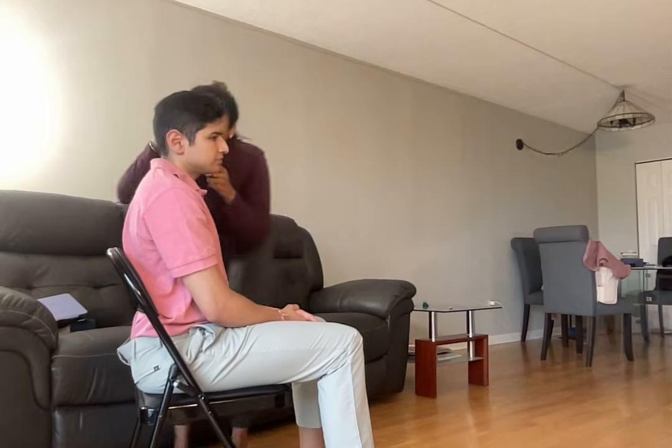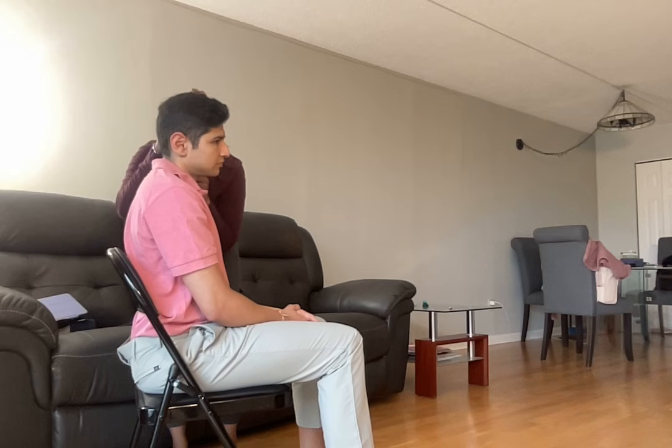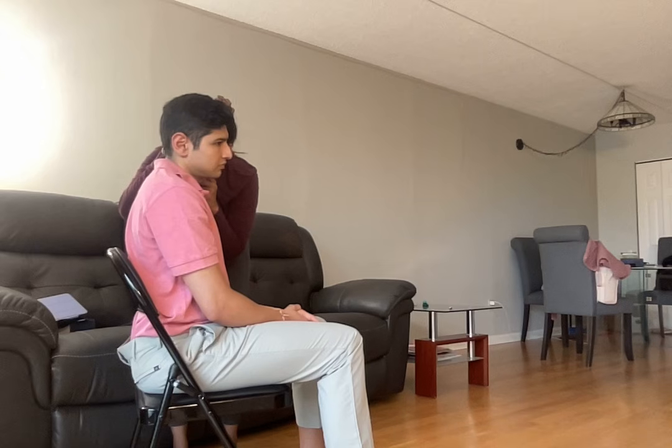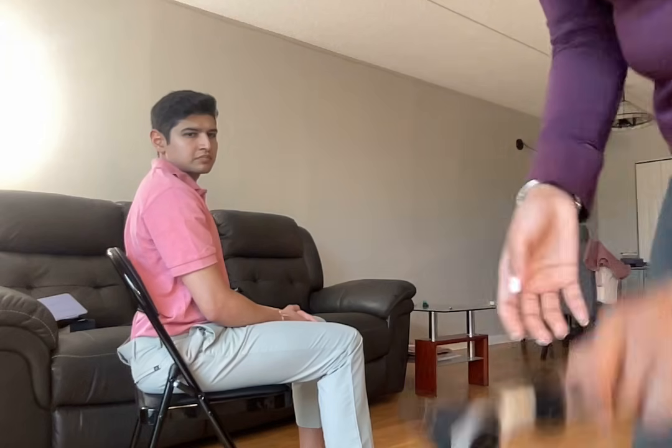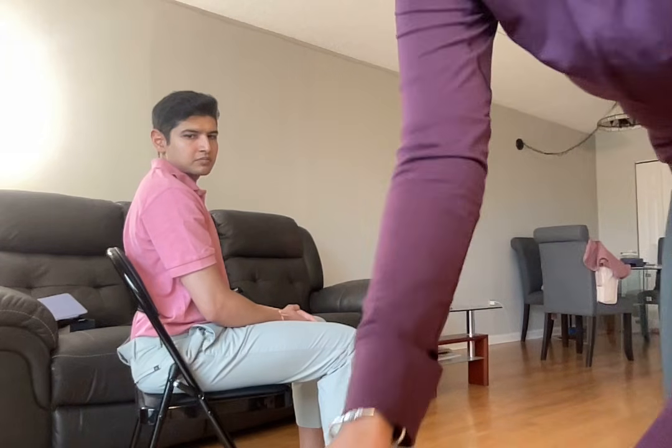I'm going to do the same thing on this side. I'm going to pull it up and back towards me. And I can see that there's a little bit of cerumen, but no foreign body, no foreign object, or any discharge or drainage. Intact pearly gray tympanic membrane.